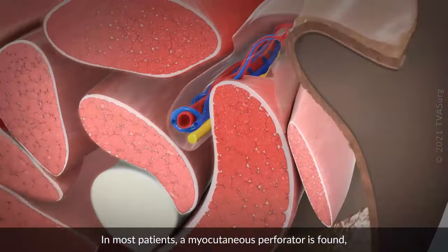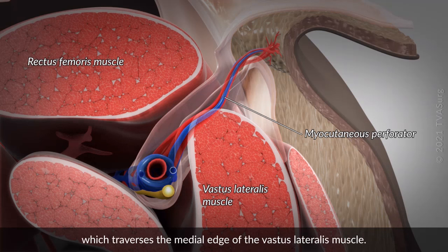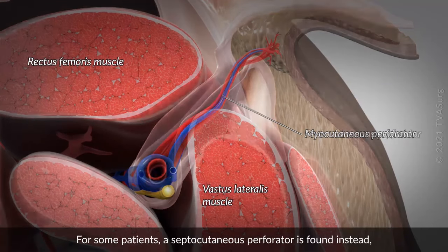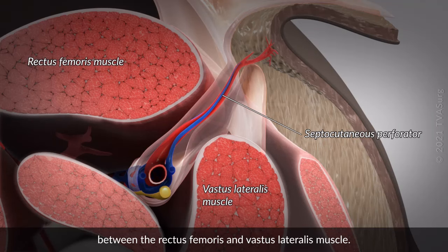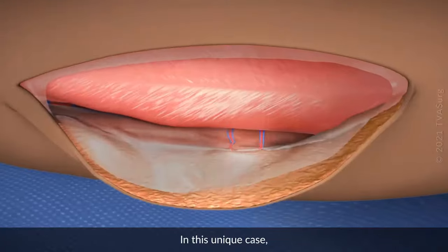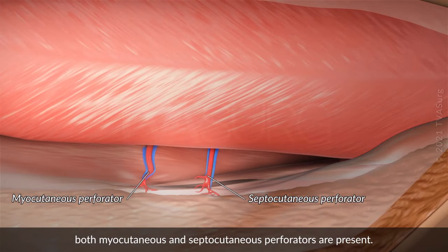In most patients, a myocutaneous perforator is found, which traverses the medial edge of the vastus lateralis muscle. For some patients, a septocutaneous perforator is found instead, which runs in the intermuscular septum between the rectus femoris and vastus lateralis muscles. In this unique case, both myocutaneous and septocutaneous perforators are present.